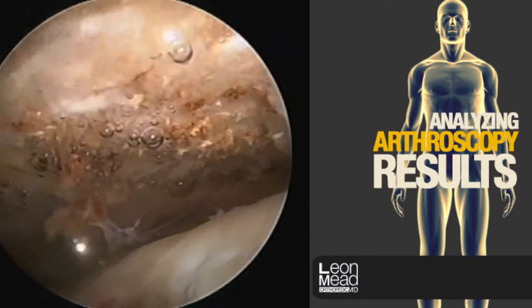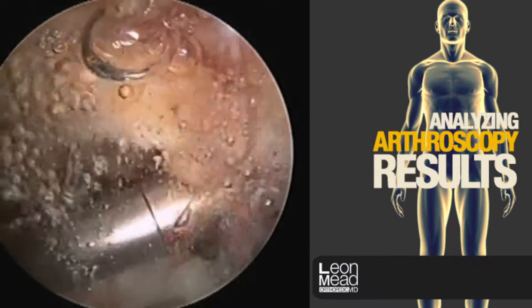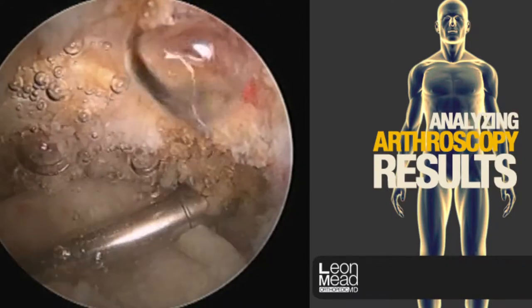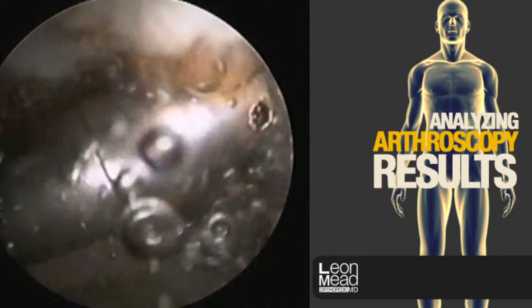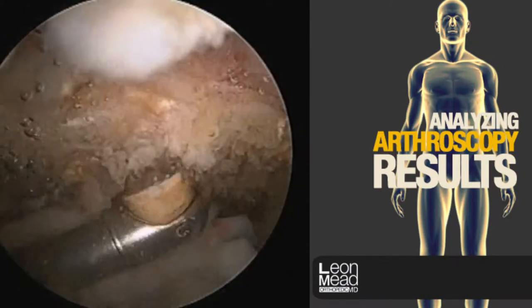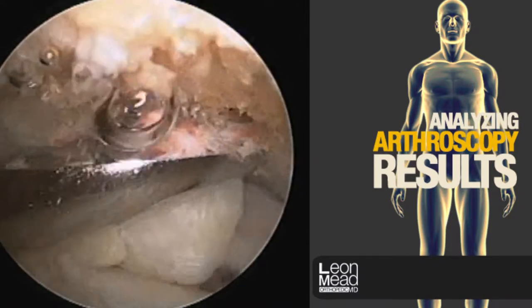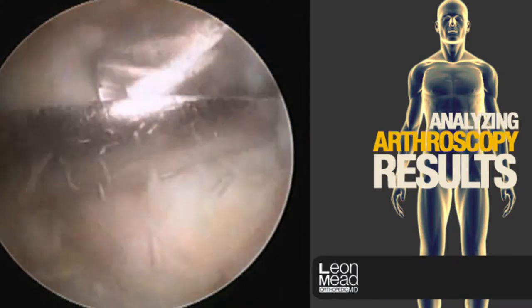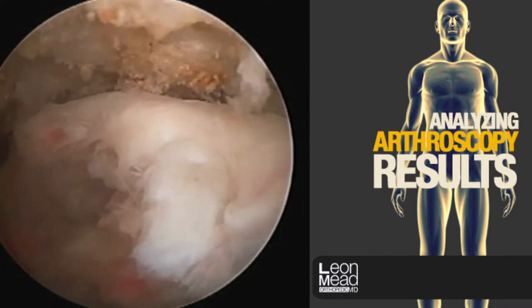Commonly associated with a rotator cuff tear is a so-called bone spur. The front part of the acromion bone frequently has a projection on its undersurface that limits the space where the rotator cuff can run. By removing this spur, we help protect our repair, and it is also associated with improved pain scores. The shaver is being placed from the back towards the front, shaving the undersurface of this spur.